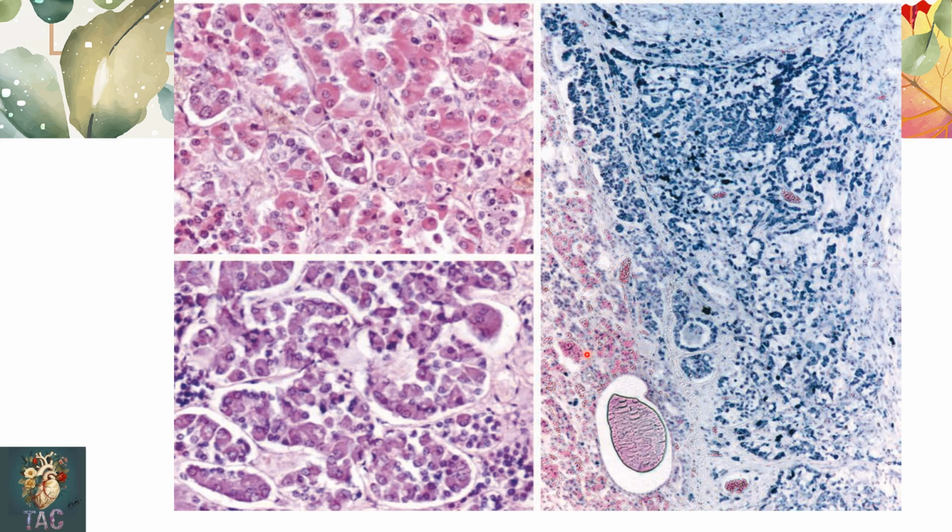This area is pars distalis, and this area at the extreme right is the pars nervosa. So in pars intermedia, a small amount of basophils and eosinophils are present. In addition, larger capillaries are also present, and cystic spaces are also seen in this slide.